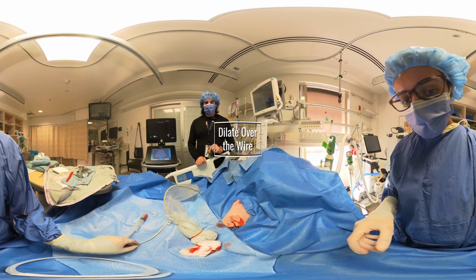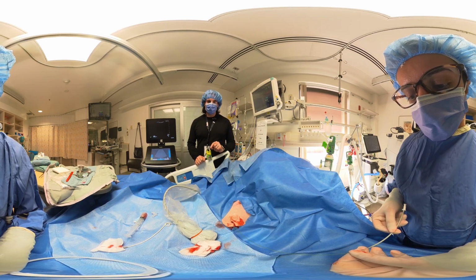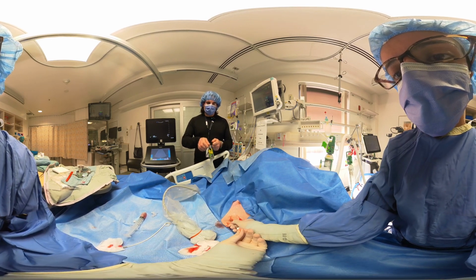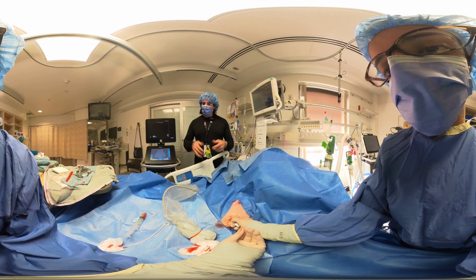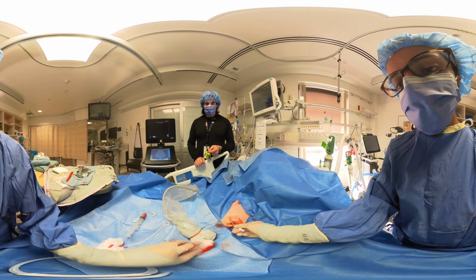So the next thing is to pass the dilator, being extra sure that we are perpendicular to the chest wall, or to the ribs themselves, just so we don't bend or kink the dilator. This will require some sustained pressure at the site with both hands. Yeah, make sure it passes nicely. Doesn't have to go all the way, but just enough to make sure there's a tract from the pleural space to the outside. Perfect. Now that's there, that can come out.